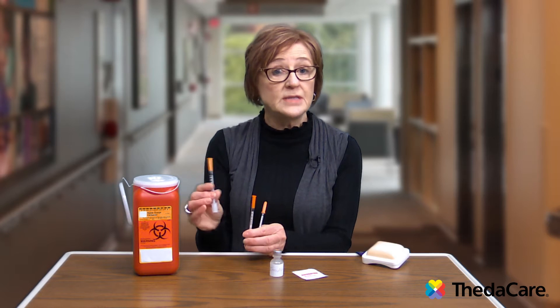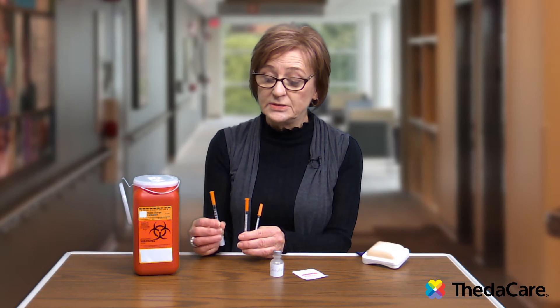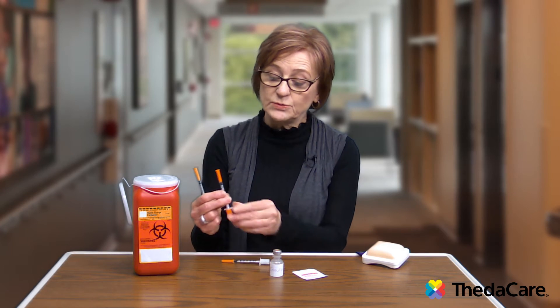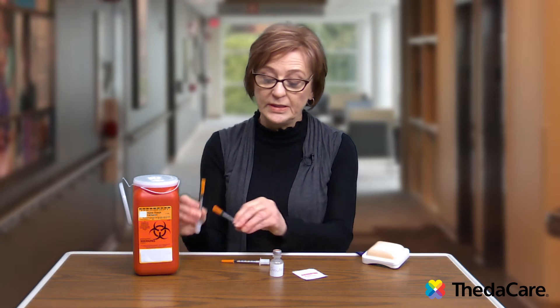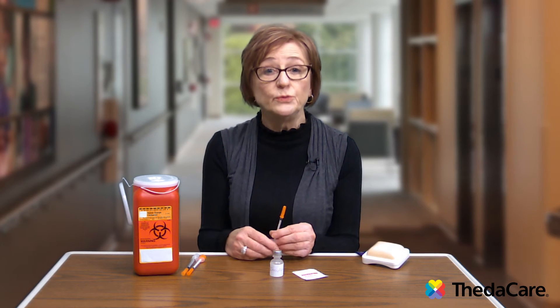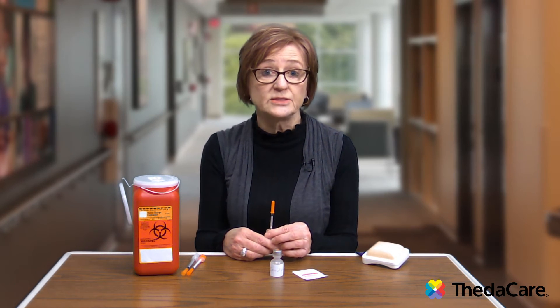There are different sizes of insulin syringes — this one holds up to 30 units, this one 50, and this one 100 units. Depending on the amount of insulin that you're going to take, you want to make sure that you have the right syringe.